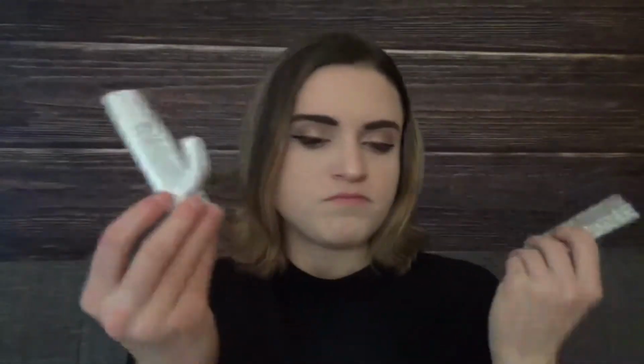And because I know my infusions are heavy, I'm not sure about everyone else's, but you just stick it to the wall, and what I like about them is obviously they are removable. So when you're done with your stay, you can just take this off the wall, be done with it, throw it out. It's like you were never there. But having this is really nice. The one drawback is that you're obviously kind of tethered to the wall when you do this. So you might need to either unplug or not move around as much, depending on how active you are in your hotel room that day.